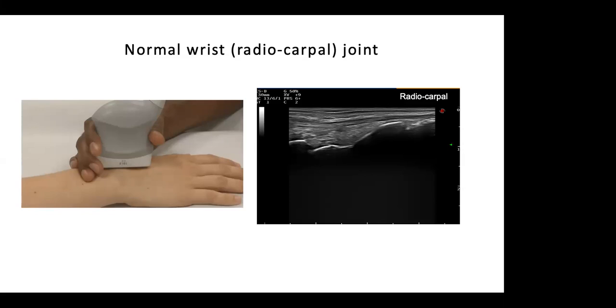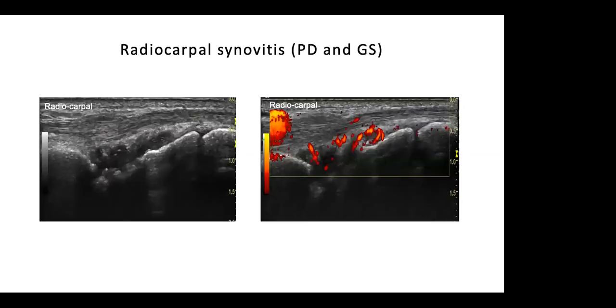If you look at the synovium, you don't really see any hypertrophy, and it looks fairly okay. The bones look okay as well. And if we look at the tendon over the top, there isn't any evidence of any tenosynovitis. So whenever I'm scanning, I'm just trying to look for lots of different things. I'm looking for as much information as I possibly can.